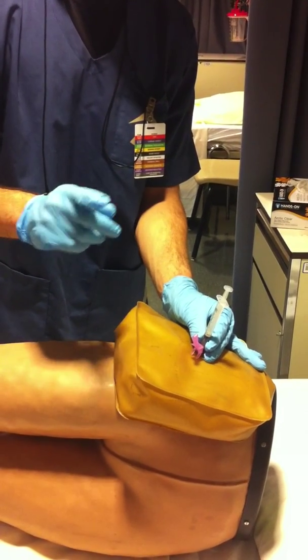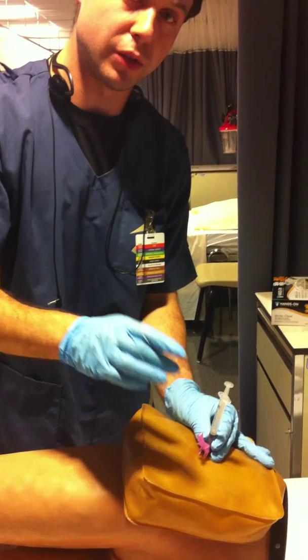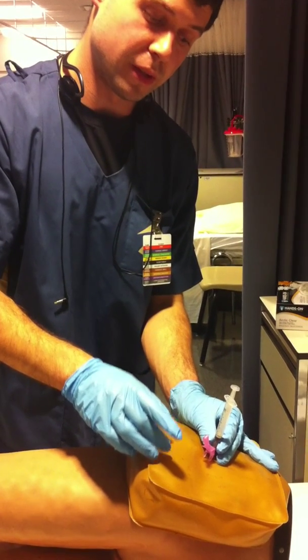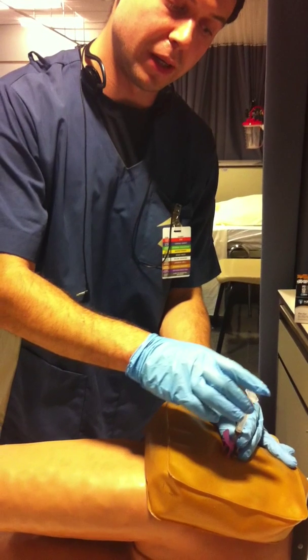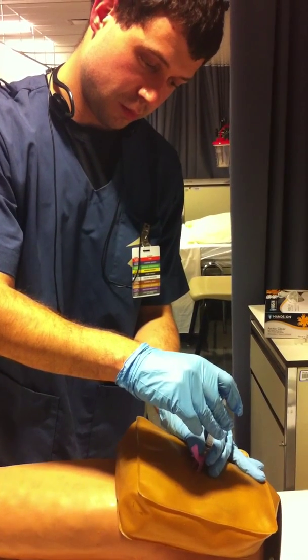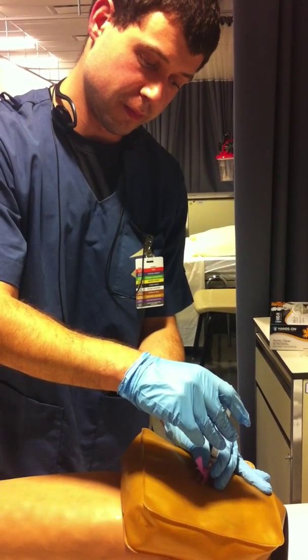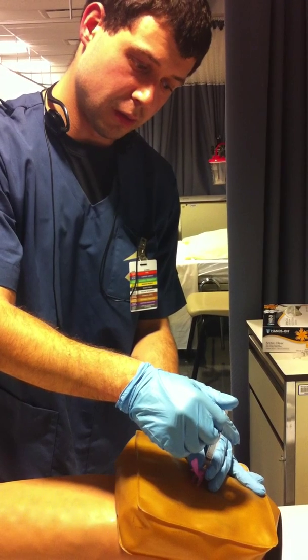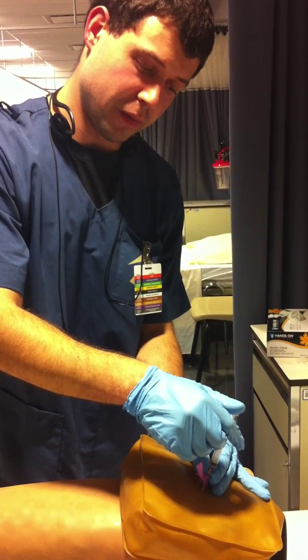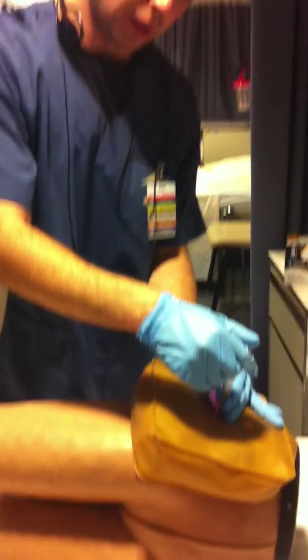Next, I'm going to aspirate the needle. I must make sure that there is no blood in that area, because if there's blood, that means I've hit a blood vessel, and I need to start over, change my syringe, change my needle. I see no blood, that means I can inject the medication. I'm going to inject it 1 milliliter for every 10 seconds. 1, 2, 3, 4, 5. Now, I'm going to hold this for 10 seconds.